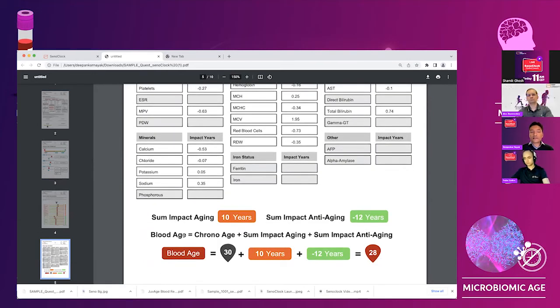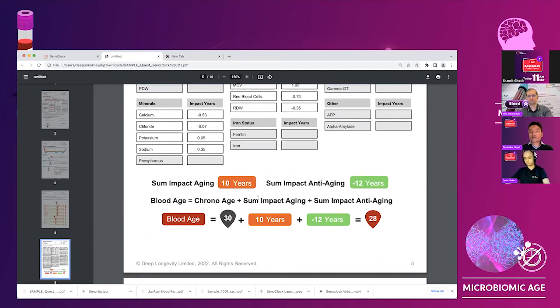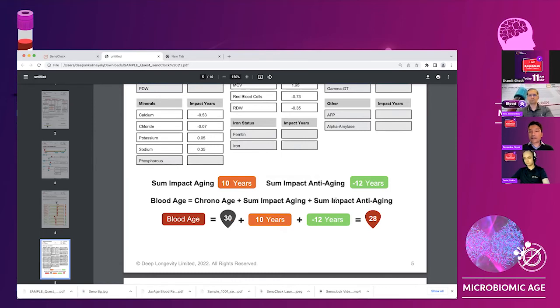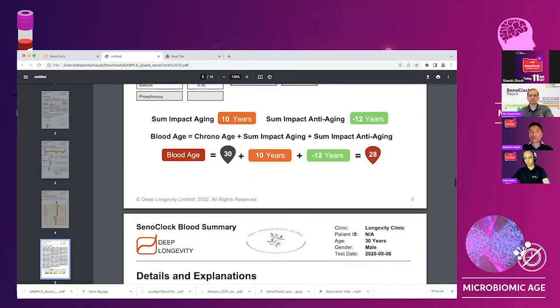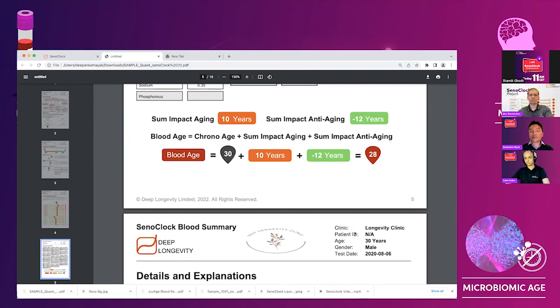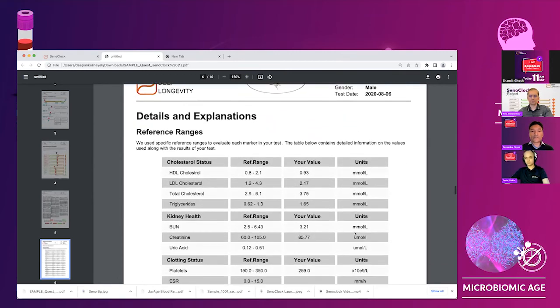But then everything is sort of clearly detailed out. And then the person can really understand that the blood age is being calculated as a sum of the chronological age, the markers which are impacting aging and plus the markers which are anti-aging. In this case, this is 30 plus 10 minus 12, which is 28 years. So the person is just not grappling with the number, right? So I've got 28 years, where does it mean, where does it come from? But now begins to understand that this is how the age is being predicted.